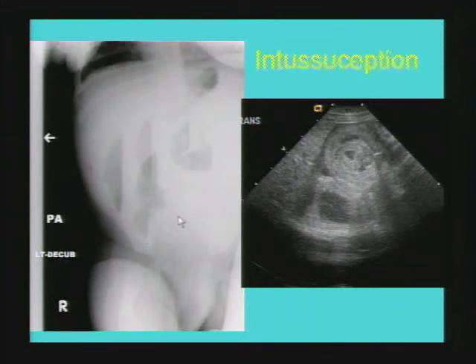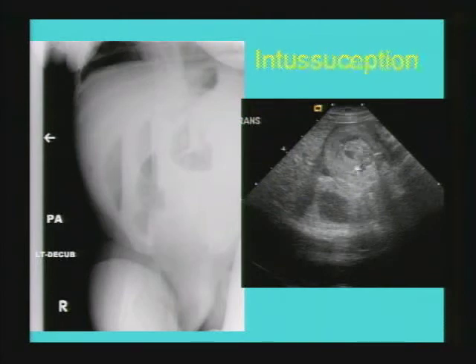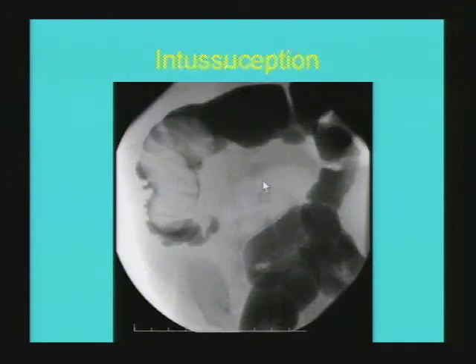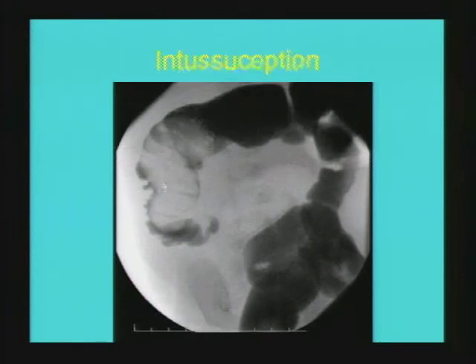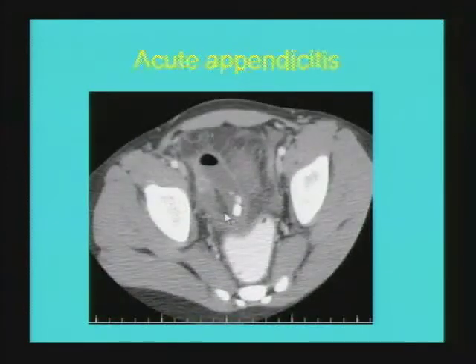The best approach is to get a lateral decubitus radiograph to demonstrate obstruction in a child presenting with bilious or non-bilious emesis. Ultrasound in this patient in the right upper quadrant shows a classical bowel-within-bowel or target appearance of intussusception. The next line of management is a contrast enema or air enema for reduction. As in this case, the contrast enema shows a sausage-shaped filling defect at the level of the hepatic flexure and ascending colon.